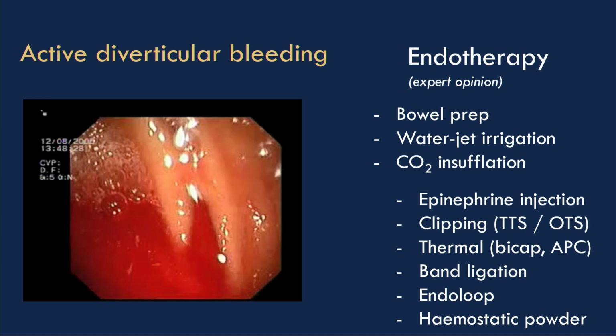Important again, use a good bowel prep before you start this kind of endoscopy. Use at the moment of your endoscopy a water jet irrigation. I would always propose you to use a cap on the endoscope.